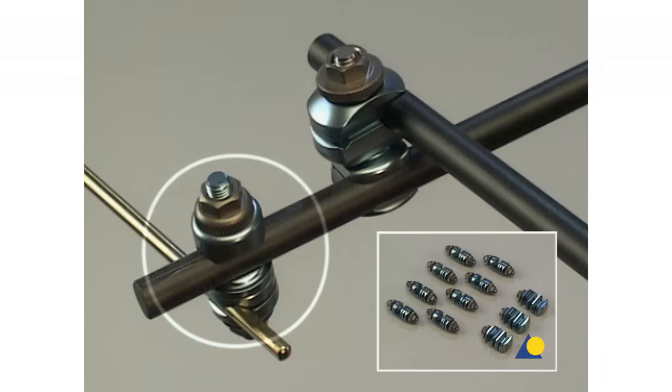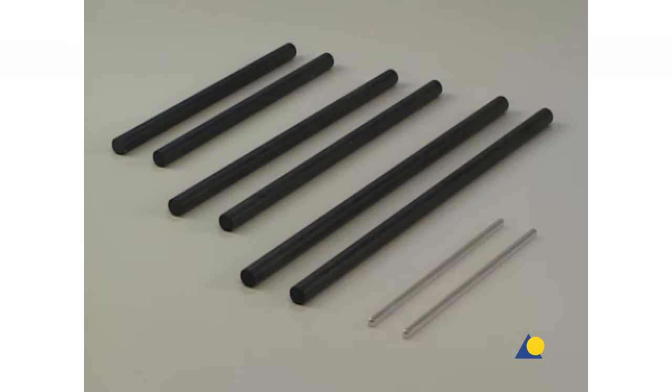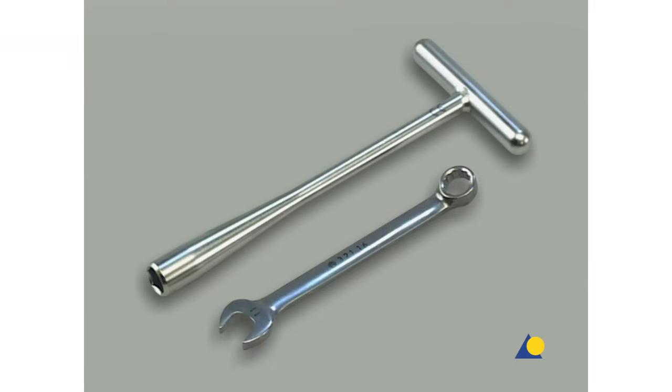Large MR-safe open-adjustable clamps and large MR-safe combination clamps will be used for the frame assemblies. Also required are 11-millimeter diameter carbon fiber rods and 5-millimeter diameter connecting rods, depending on the frame construction. To tighten the frame assembly, an 11-millimeter socket wrench and the 11-millimeter combination wrench are needed.